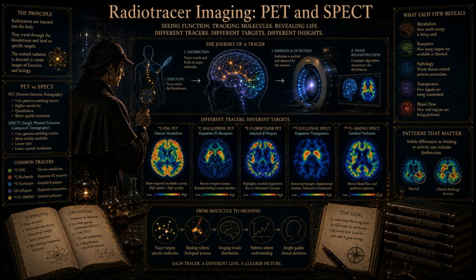So in our mathematical model, we don't calculate a binding potential. Instead, we calculate a parameter called Kin, which is the steady-state macroscopic uptake rate constant. Kin represents the exact speed at which the tracer is being irreversibly trapped. When we apply a mathematical conversion factor, the lumped constant, to account for the slight difference in how the brain handles 18F-FDG versus true glucose, we can accurately quantify the absolute rate of regional cerebral glucose metabolism.